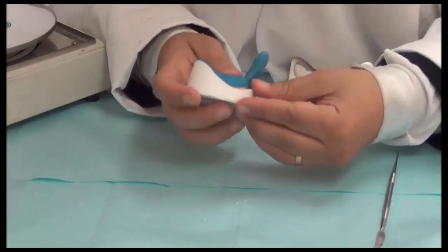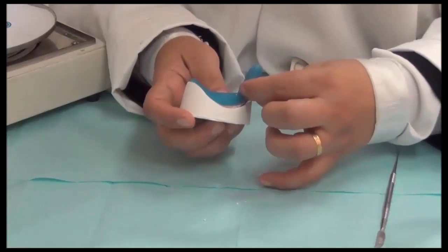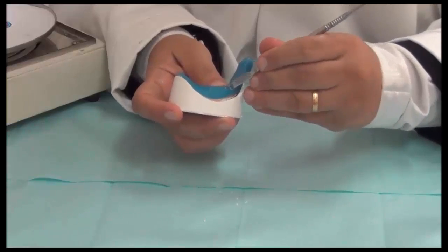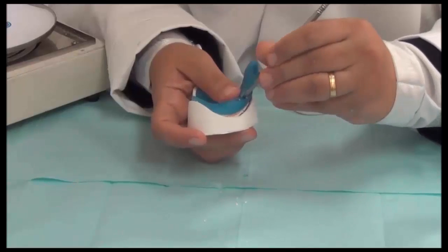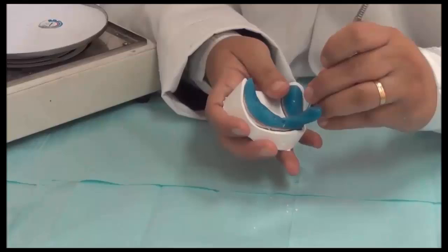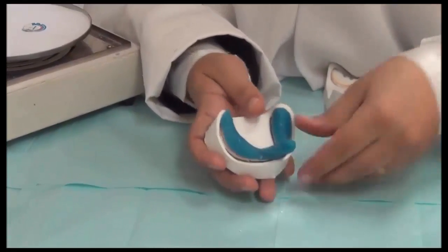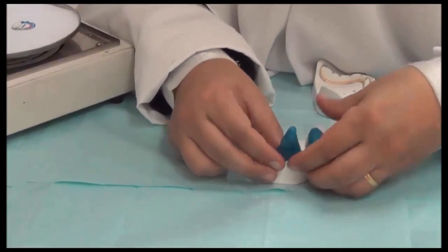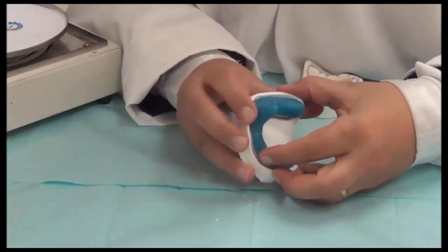And to make sure that it's adapted well, when we have done the first layer, we don't place Vaseline in this area to make sure that the handle adapts to it. And wherever a hole is covered, we re-expose it to make sure it's still present in the handle as well, with the presence of the handle. So the handle is in. We thinned it. We have removed the bulk from here. We have removed the bulk from here.